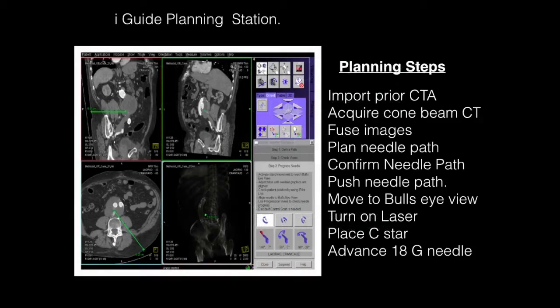This shows the interface in the iGUIDE planning station used to develop a needle guidance path, shown in green in the lower left panel. The planning steps include importing a previously obtained CTA, acquisition of cone beam CT in the hybrid room, fusion of these two images together. On the workstation we then plan the needle path, confirm that needle path, and then push it onto the live fluoro system in which we're going to perform the procedure.